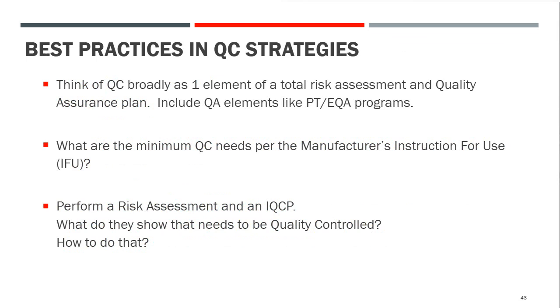So best practices in QC strategy, think of QC broadly as one element of total risk assessment. What are the minimum QC needs from the manufacturer's instructions for use? That needs to be a factor in your assessment of what needs to be done. It's usually considered a minimum. There are ways through that.